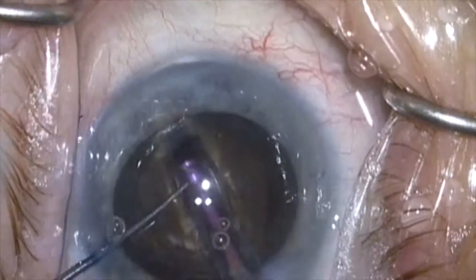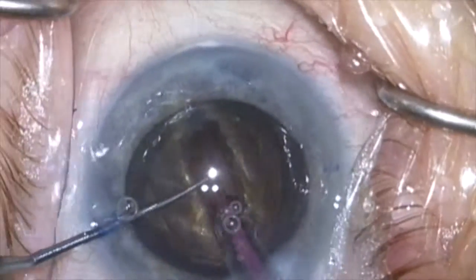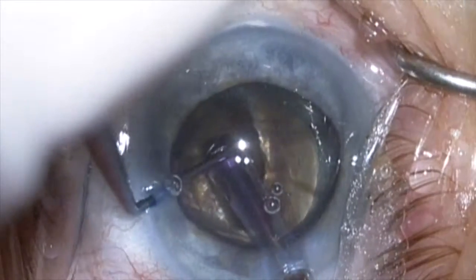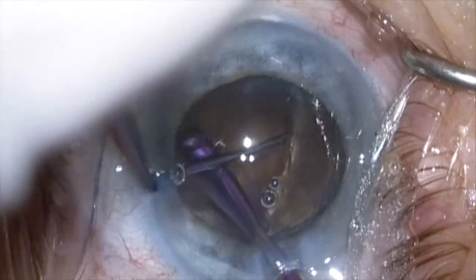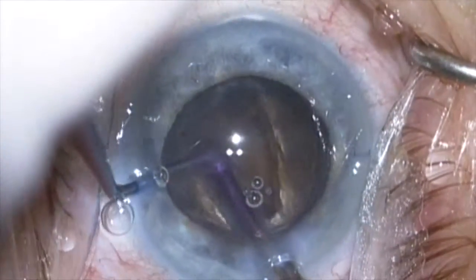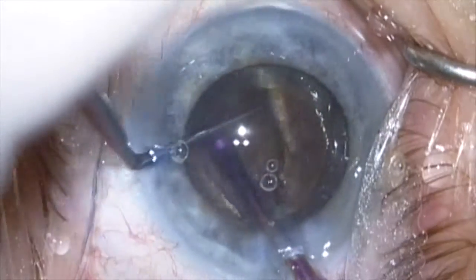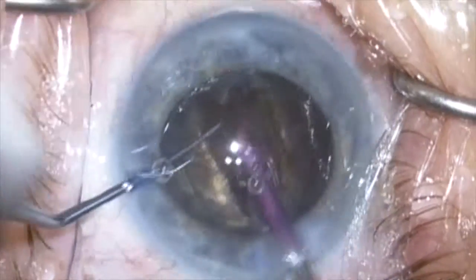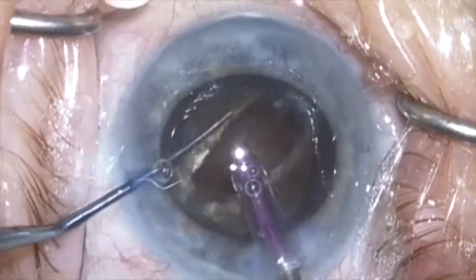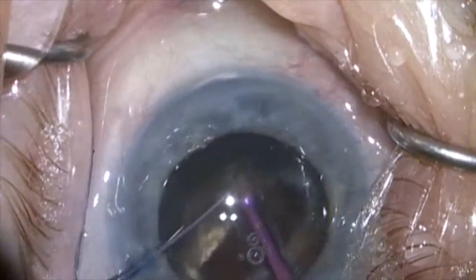I'm continuing the deep wide central groove, and when I feel I'm deep enough I'm going to reach down into the base of the groove and split the lens from the bottom up. I feel it's very important to achieve a crack that goes through the posterior plate. I keep pushing until I achieve that, and now I'll rotate the lens a bit and tear off the first piece of nucleus using a chopping technique.